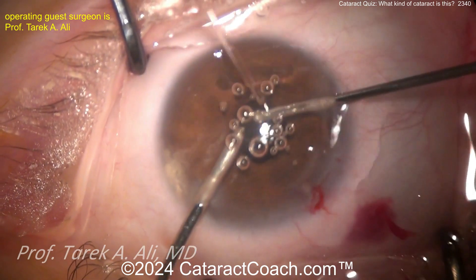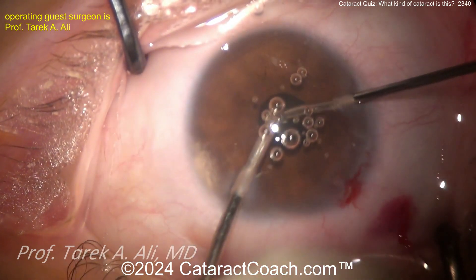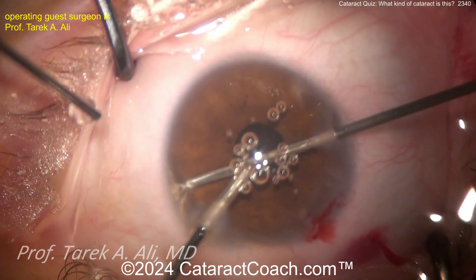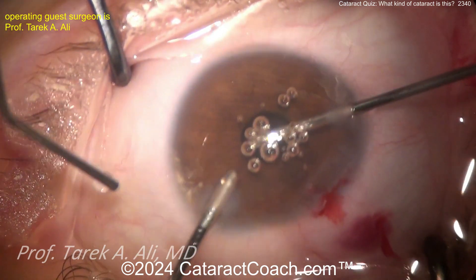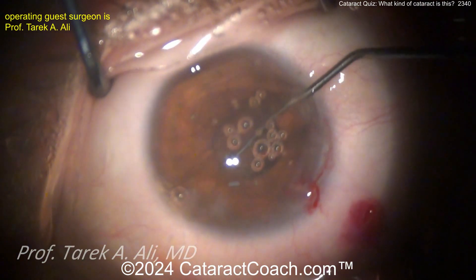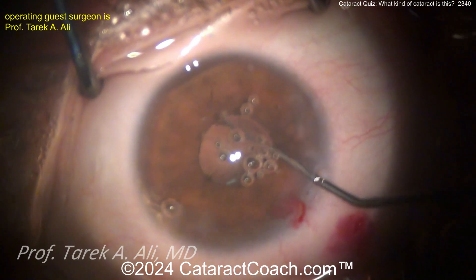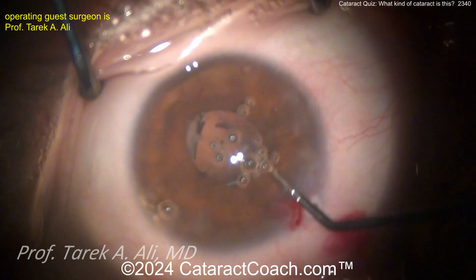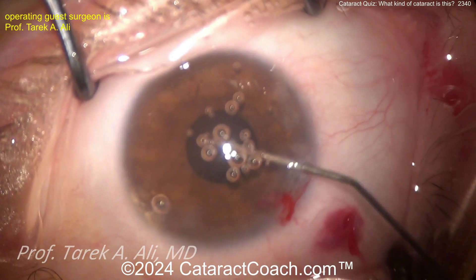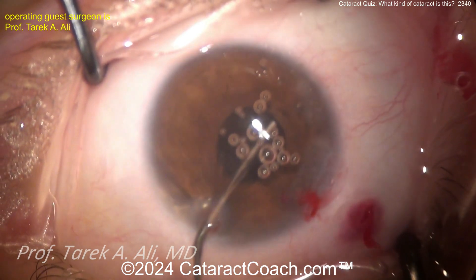That's beautiful, because it shows you if there's any vitreous prolapse. The pupil came down — what are you going to do here? Do you want to stretch the pupil, put some hooks in? For the IOL replacement, if you don't open up that pupil you may end up putting that new IOL in the sulcus. I'm using a Y-hook here, pulling the iris around and seeing what support we have. Changing to the red reflex for a better view — good idea — and now opening up the sulcus.